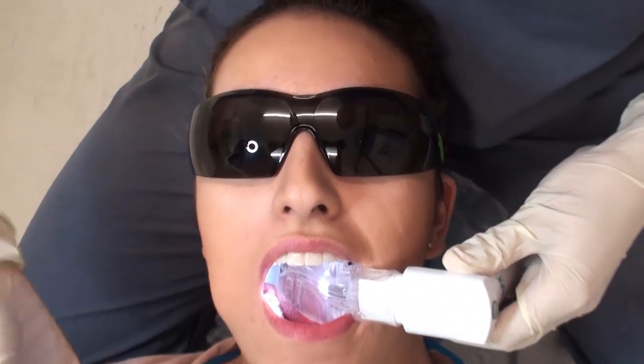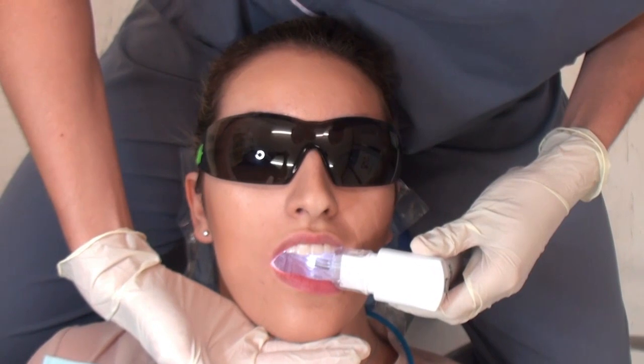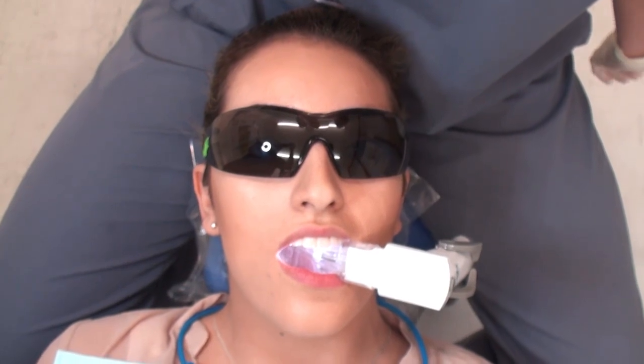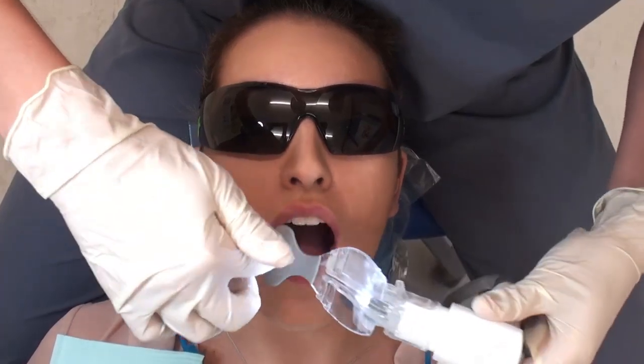Once the mouthpiece is in position, ask the patient to rest their teeth onto the bite block. And there you have it — quick and simple placement. When you need to work on the opposite side of the mouth, simply remove the mouthpiece, turn it over, and do the same thing again.